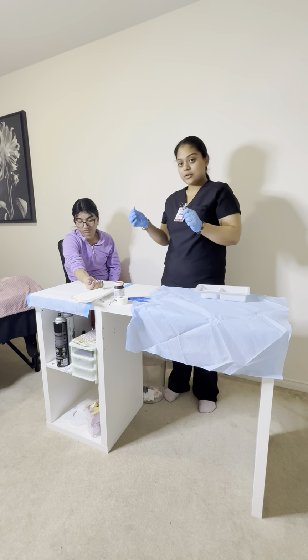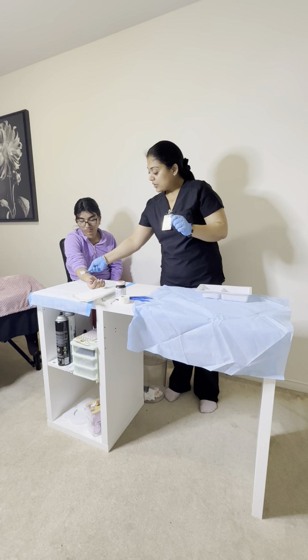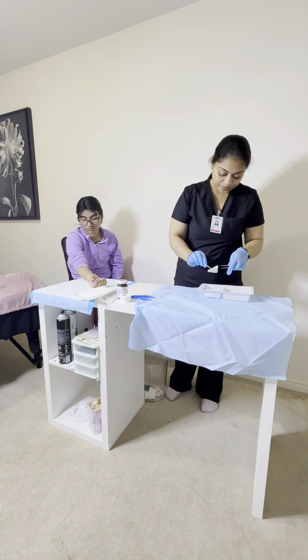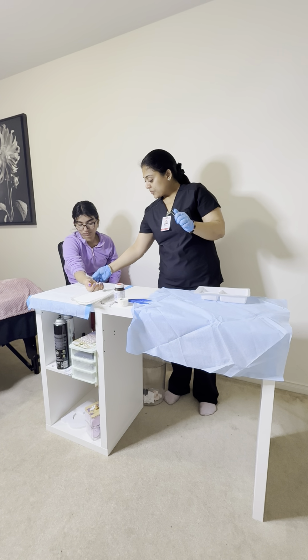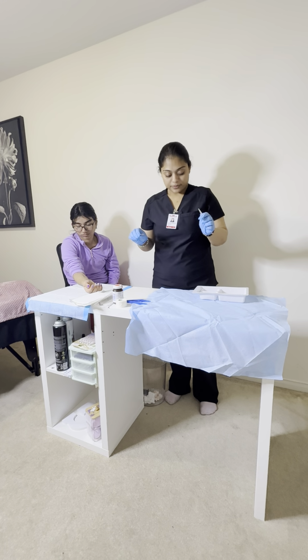Take another gauze, pat dry the farther area of the wound from top to bottom. Another gauze, going to pat dry the nearer area from top to bottom, putting that in a bin.